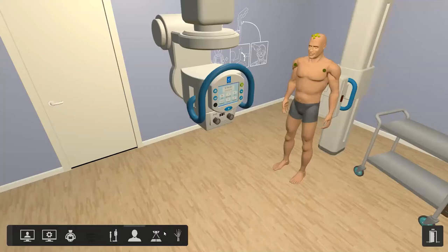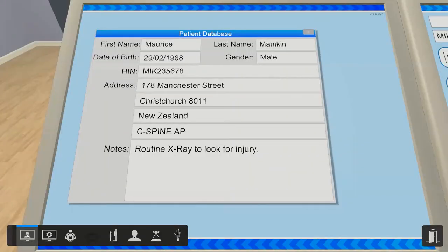So immediately we'll go through the icons down here on the bottom. The first one is your patient database and you should be able to get all of the information you'd expect to see, like you would see on your referral form. We've got Morris the mannequin in here — he's got a name, a date of birth, a hospital information number, and just some notes.